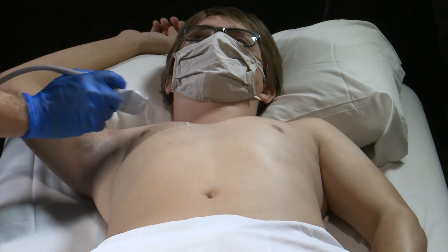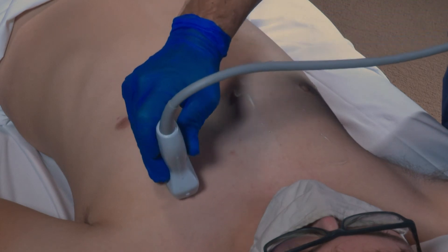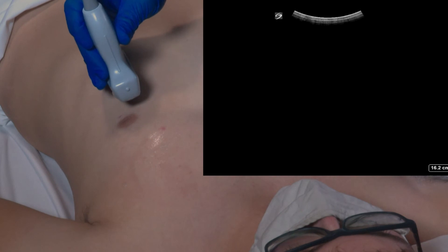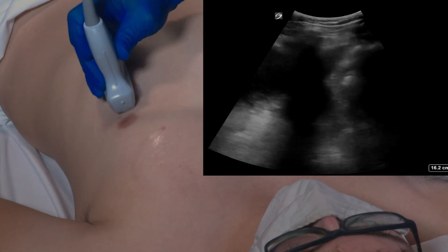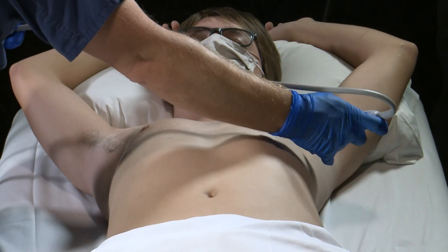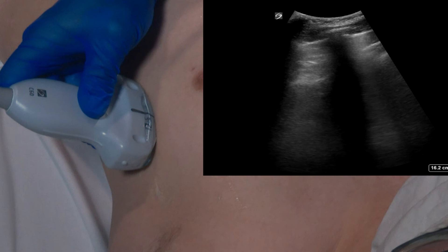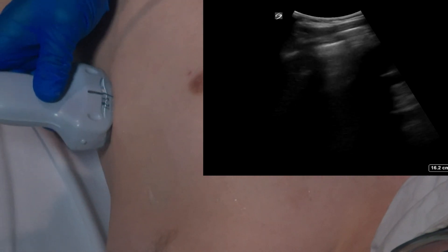Next we will move over onto the left chest. We will start in the anterior superior zone, moving the transducer around this area looking for any evidence of B lines. We will then move into the anterior inferior zone — in this zone we may need to move the transducer around quite a bit to get around the heart. Next we will move into the lateral superior zone on the left chest, moving the transducer throughout looking for any evidence of B lines. Our final view will be Zone 4 of the left chest, the lateral inferior zone, where we will move the transducer around looking for any evidence of B lines.